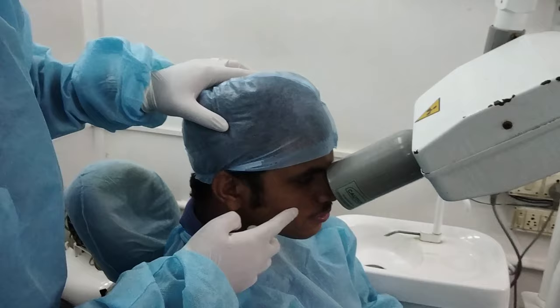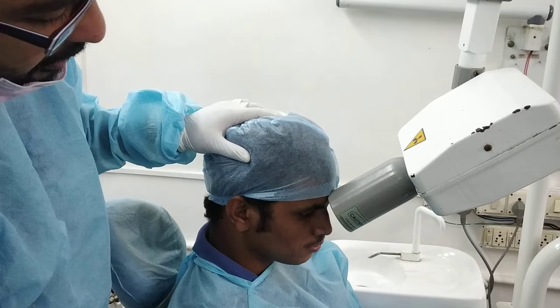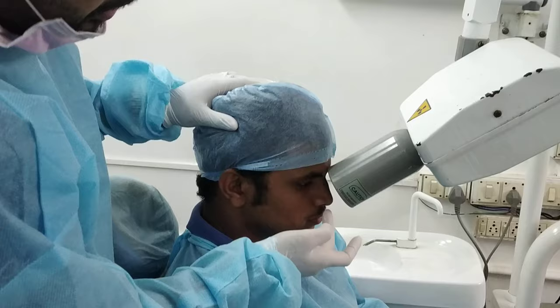Before starting the procedure of any x-ray, we need to know that for maxillary teeth the head should be tipped down so that the Frankfurt horizontal plane is parallel to the floor. For the mandibular teeth it is different. As you can see here, this is the maxilla and we are taking the x-ray of the upper anterior tooth. The head is slightly tipped downwards so that the Frankfurt horizontal plane is parallel to the floor, and I am focusing this x-ray cone along the angulation tube.